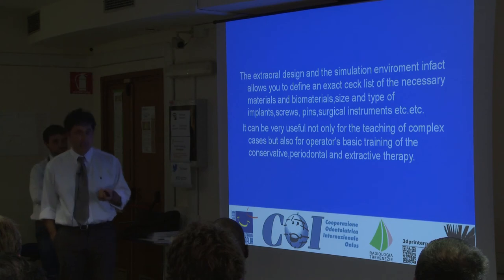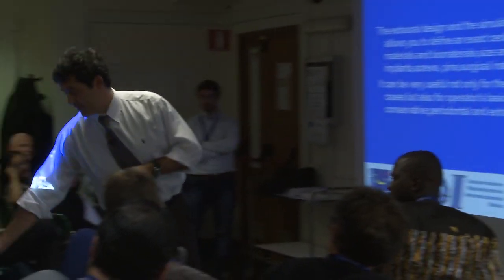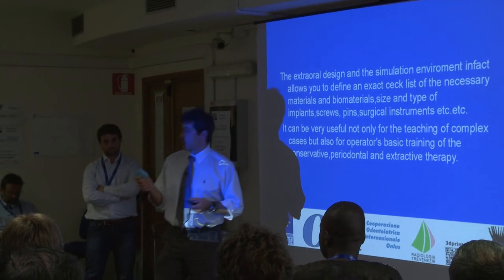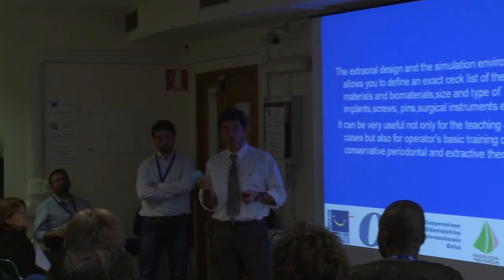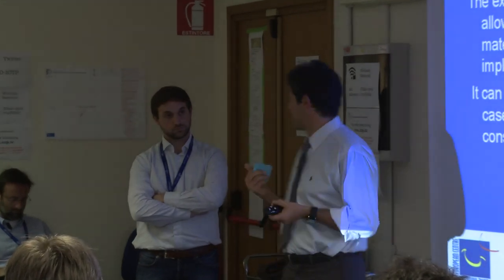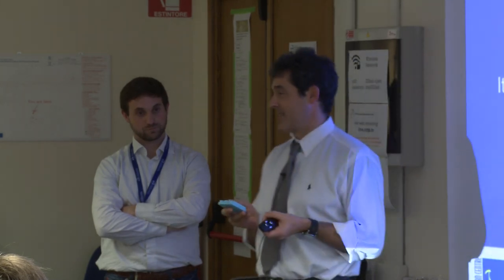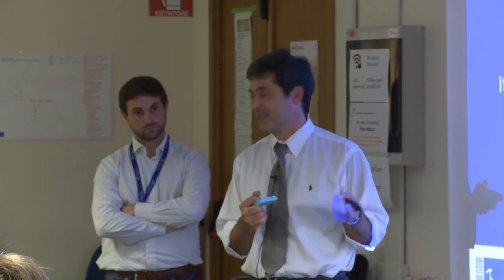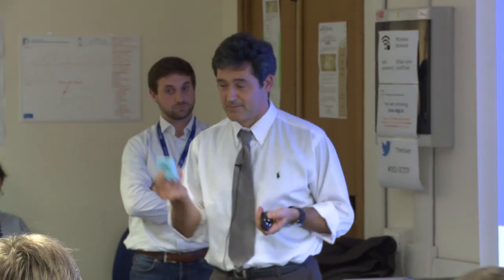The new frontier is to build using polylactic acid, which is a biomaterial. It is completely resorbable, and you can decide the resorption time you want to build spare parts of the body. Before you remove a part, for example in that big case, you can, using reverse engineering, build a new spare part of your body. And then you can use it as a scaffold for stem cells or something else. But it's very beautiful, because it costs less than 20 euros.